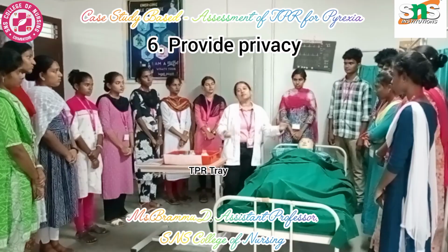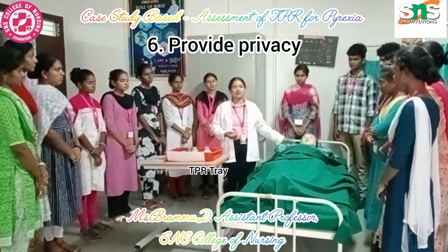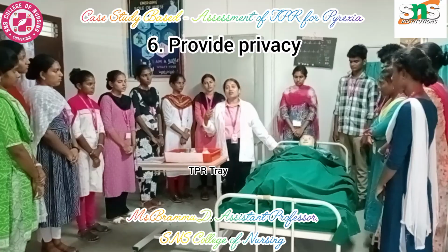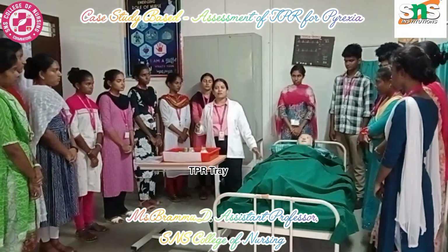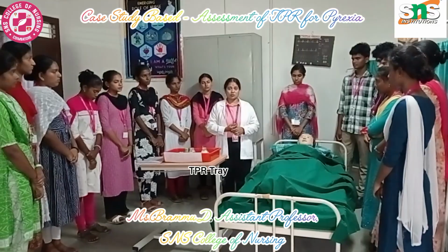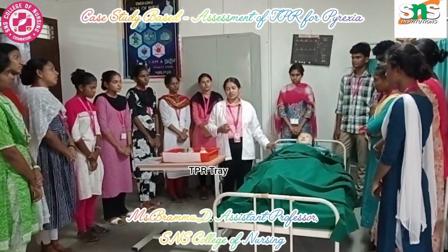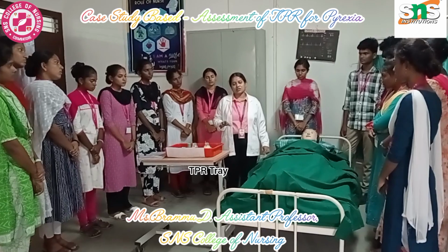Providing privacy. So privacy means, if it is axillary temperature or rectal temperature, you may need to have privacy by providing the screens, because you are going to expose the private part. Other than that, if it is an oral temperature, no need for any privacy.